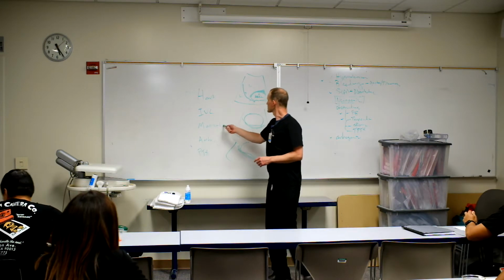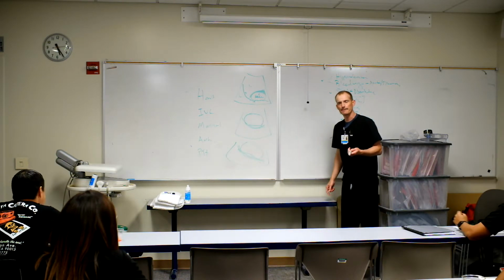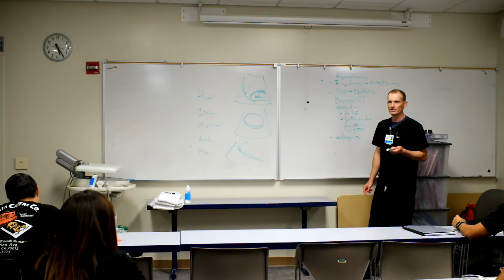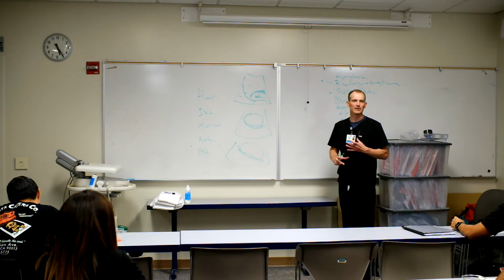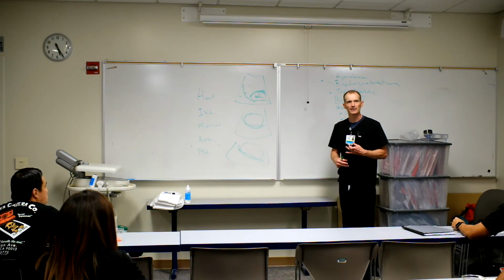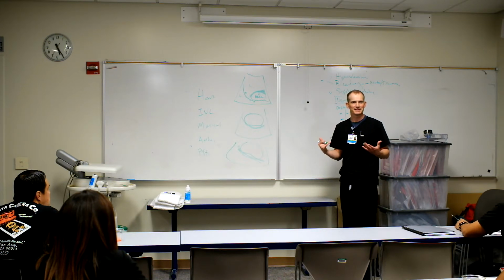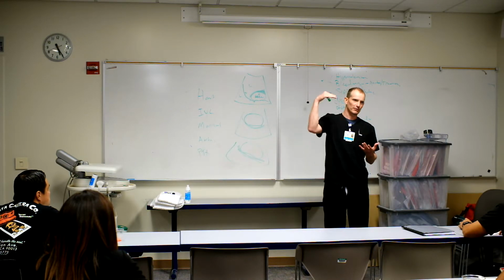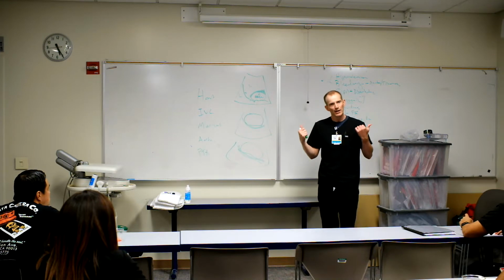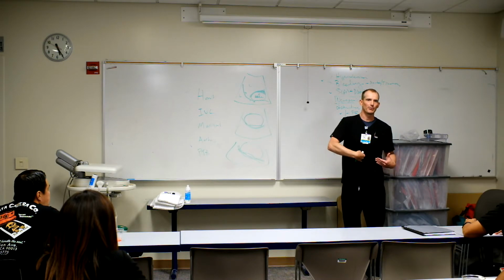Okay, so that's the Morrison's pouch, and then you go to the aorta, and this is going to be probably the hard one. And if you don't get it right away, I would just say move on. If there's a big aneurysm in there, it's usually pretty easy to see. It's the normal aortas that are hard to see, okay, and it takes some patience, because the bowel is filled with liquefied poop that's not on its way to real poop yet, right? And there's air and stuff in there, and when the sound waves hit the air, they just scatter everywhere. So you have to get the bowel out of the way between your probe and the aorta.